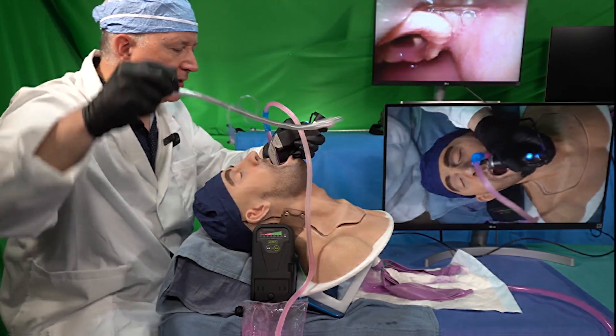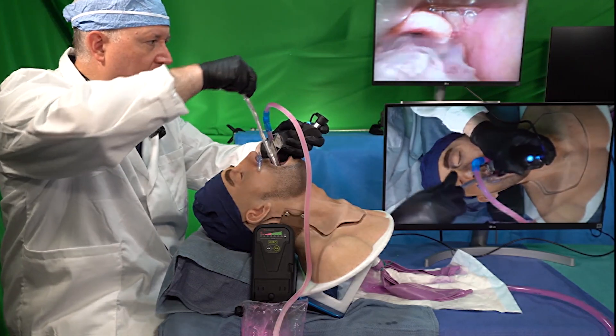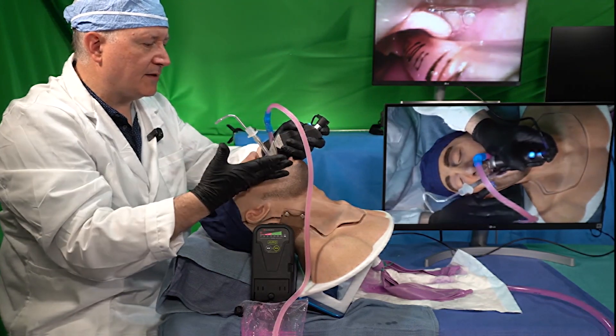I'll go ahead and complete the intubation now. I can do this under both video and direct laryngoscopy on this mannequin.